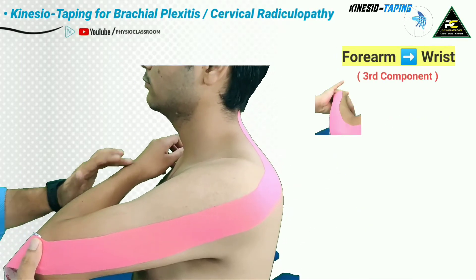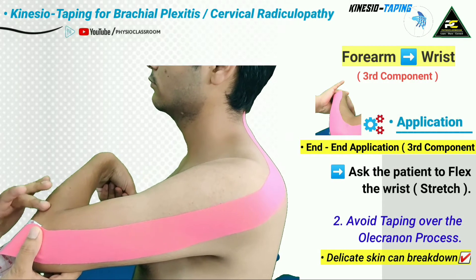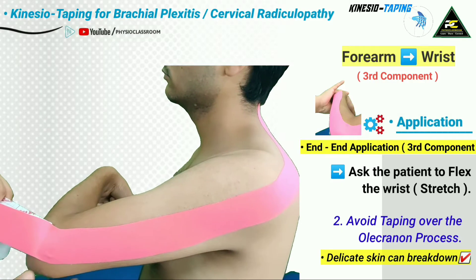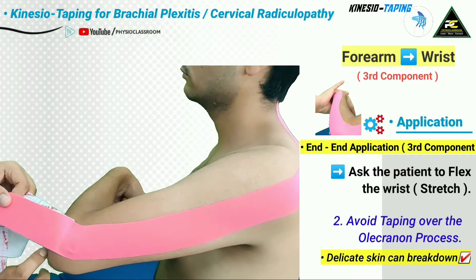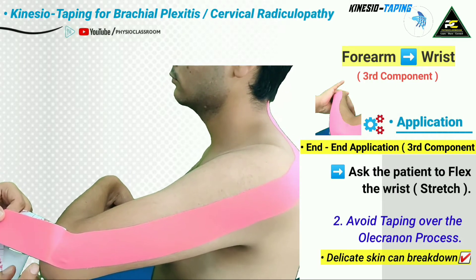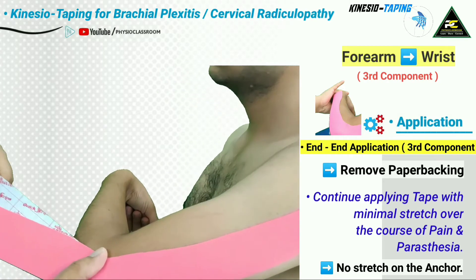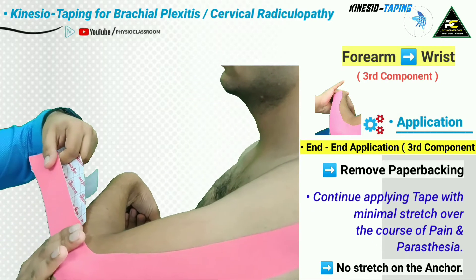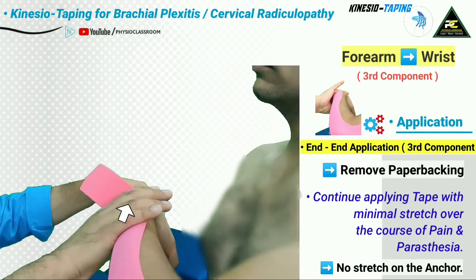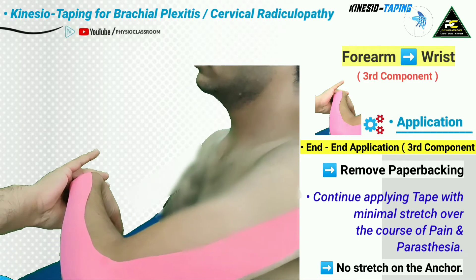For the third component, the overlying forearm skin is stretched by asking the patient to flex the wrist. It is also important to miss the olecranon process during taping, as the overlying skin there is delicate and can easily break down. The tape is then continued with minimal stretch following the course of the pain, and finally with no stretch the remaining tape is applied over the wrist joint.